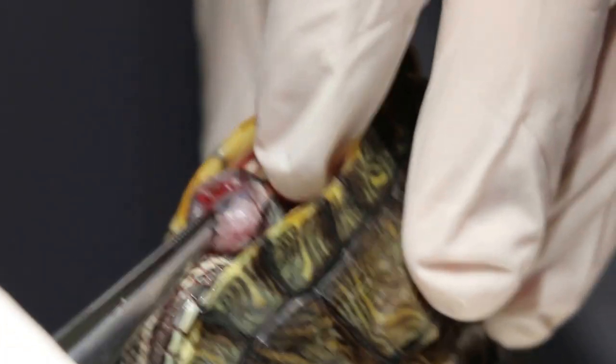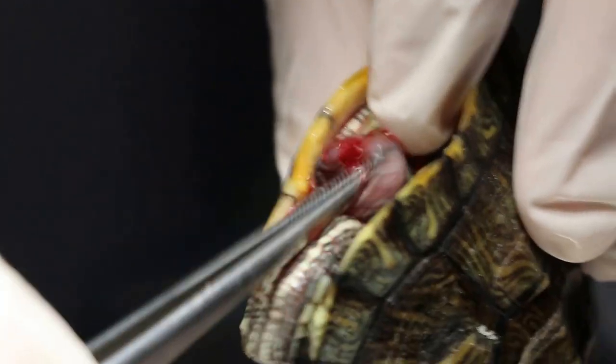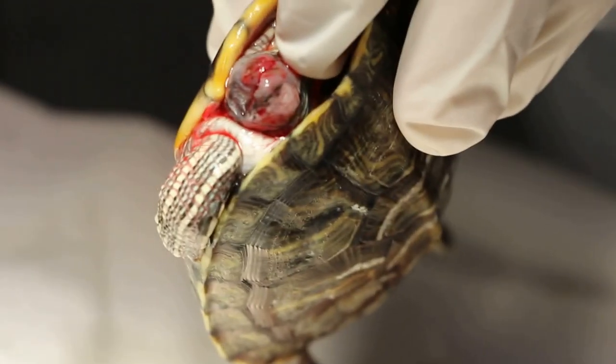See if there's any more — check 360 degrees. That's so much more. Then use the string before he wakes up. Should be okay here. Then use the fingers to feel if there's any more.